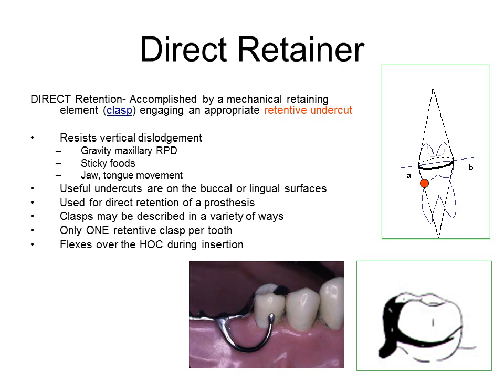Two different clasp types are shown in this illustration. The retentive tip engages the tooth in the gingival third of the tooth. It should be located at least 1 mm away from the free gingival margin. Usable retentive areas exist on the buccal or lingual of the abutment tooth and range from 0.01 to 0.02 inches in depth, relative to the height of contour.